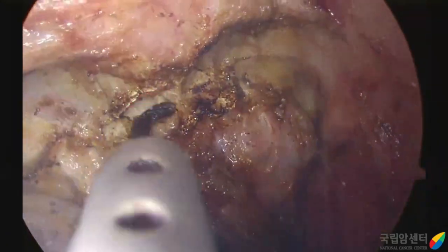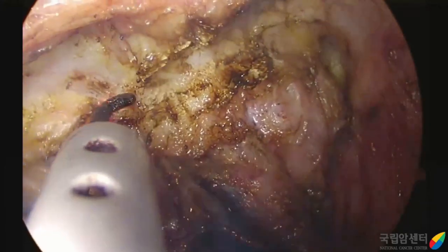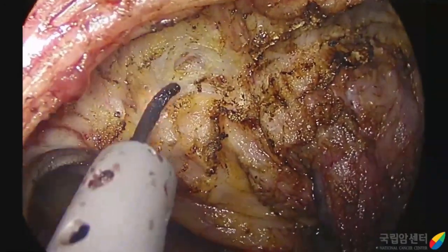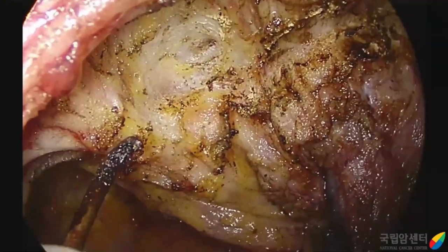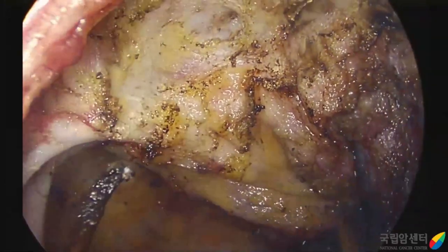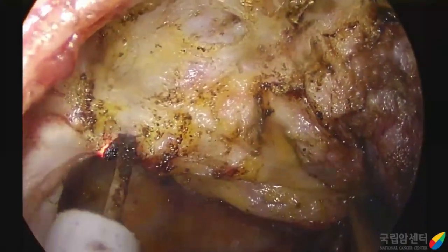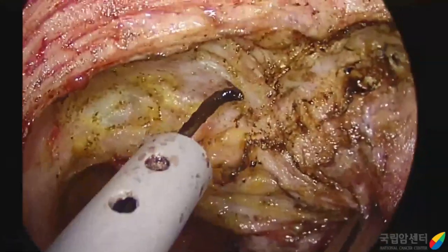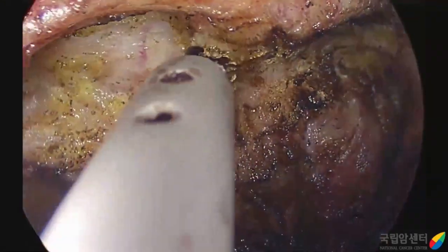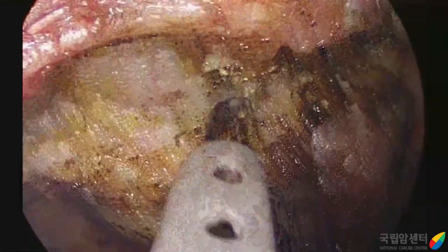In difficult cases, direct palpation of the Foley catheter or use of fluorescence dye is recommended to avoid urethral injury. The landmark of anterior dissection in male patients is the prostate, and the vaginal wall in female patients.